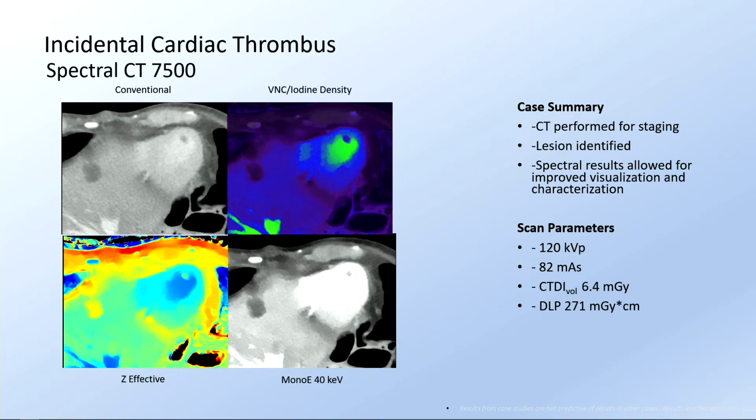And I'm sure you've had cases where you find LV thrombus, in particular if you're doing patients more in the acute setting or patients with cardiomyopathy. And sometimes this may not be seen. Or sometimes we have to use CT also. We had a case the other day where there was a suspicion for LV thrombus. The patient had an ICD already, so we decided to go with a CT. And Spectral can help in this also in the detection, visualization of LV thrombus. In this case it was an incidental finding, but it can also help our radiologist colleagues in the detection of these cardiac incidental findings.